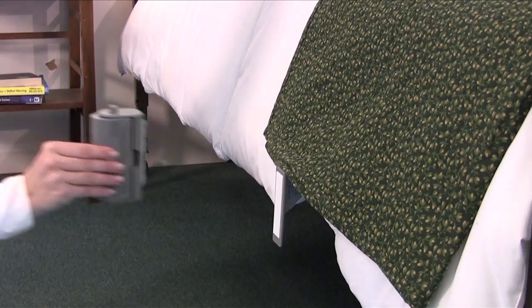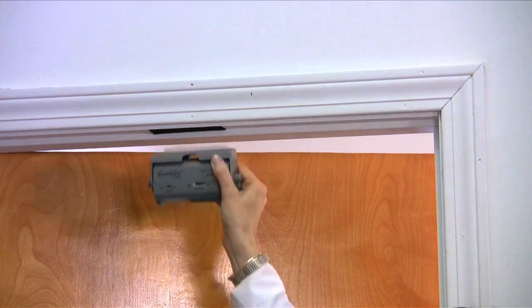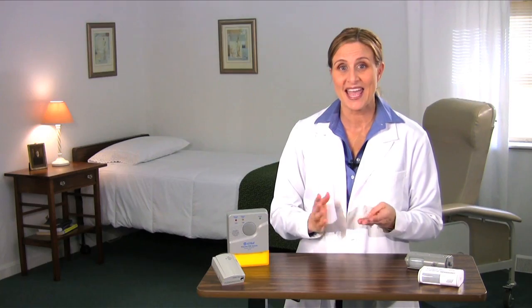They can be placed just about anywhere to monitor a patient — by their bed and even over the door to detect patients trying to exit the room. And they serve as a covert alarm system that goes undetected by the patient. They won't be able to tamper with the alarm or prevent it from sounding.